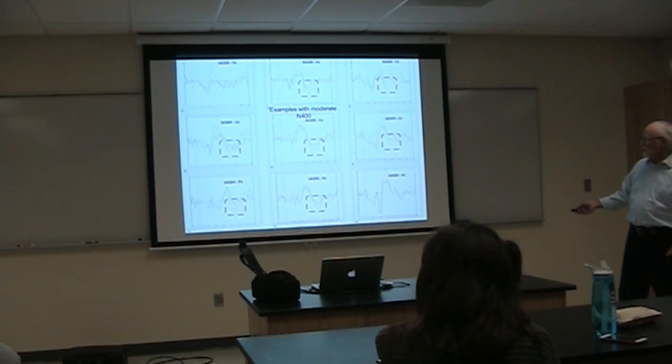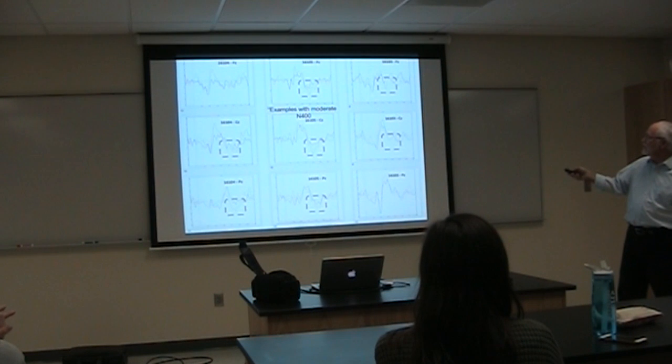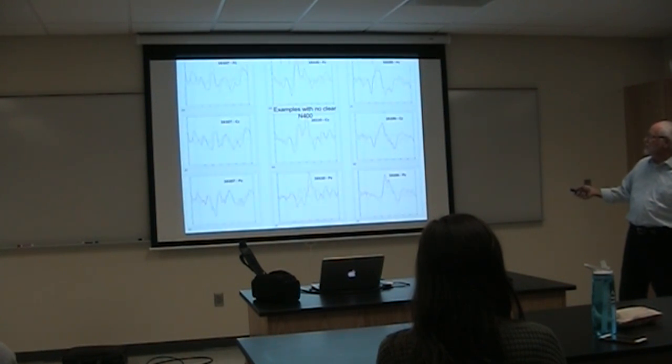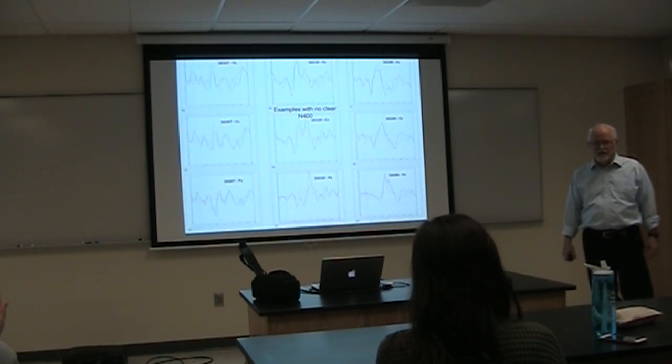We had more participants last semester that only showed a moderate difference between the nonsense and the actual meaningful sentences. We had some people that just barely showed a difference, probably not even statistically significant. And then we had 3 people who didn't show any clear N400 at all.